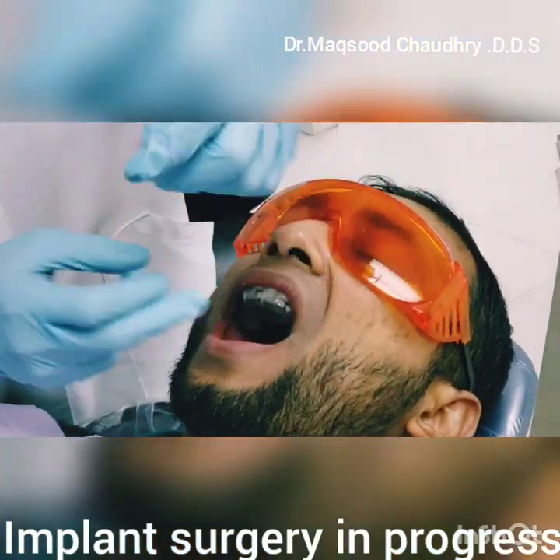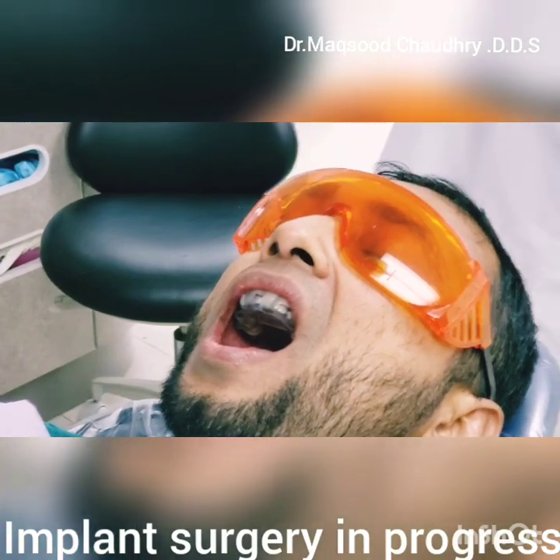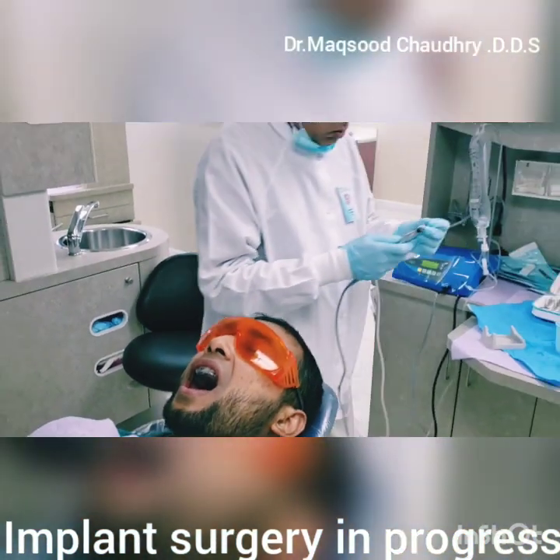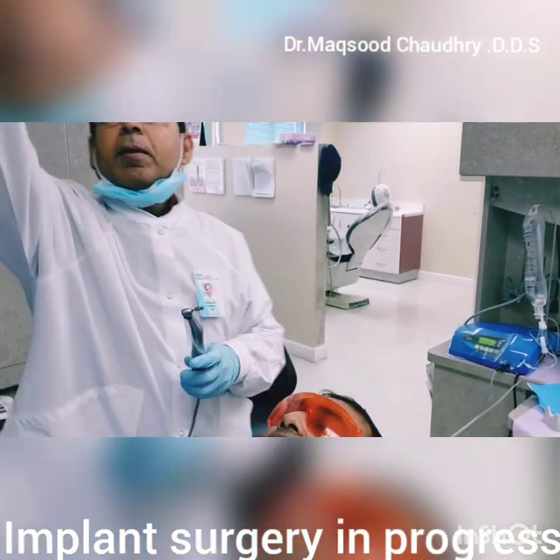Now we do the tissue punch. The first step is doing the tissue punch. With the tissue punch, we were able to open the tissue of the proper size.